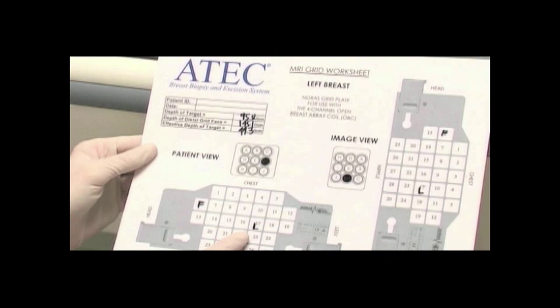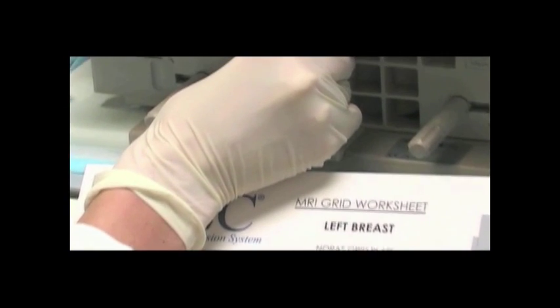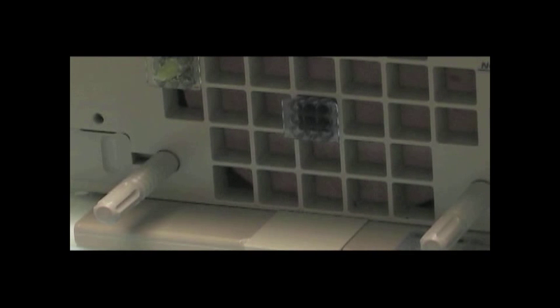Looking at the compressed breast in the grid, match the location marked on the grid worksheet to the actual compression grid square. Insert the nine-hole needle guide in the appropriate grid space based on the targeted calculation.